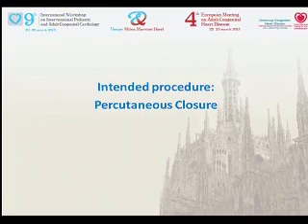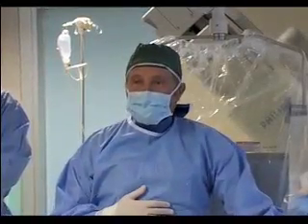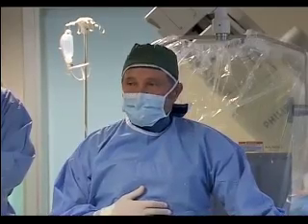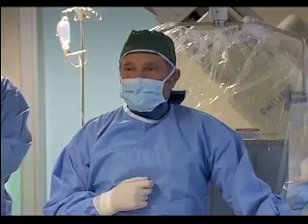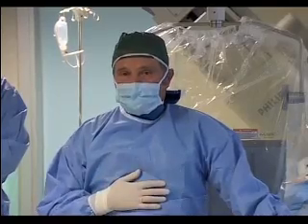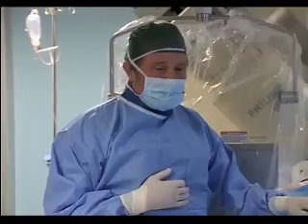Okay, thank you, Francesca. Carlos, well, this is a straightforward, at least medium-sized PDA. Usually, it's very difficult from echocardiographic findings to identify the precise morphology and size of the duct. You may agree with that. Yes, I do.